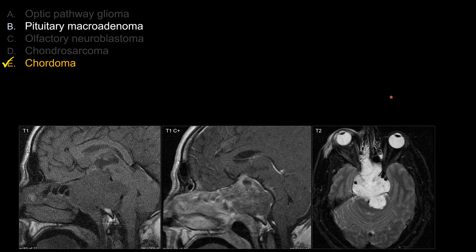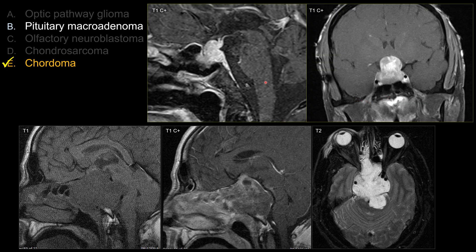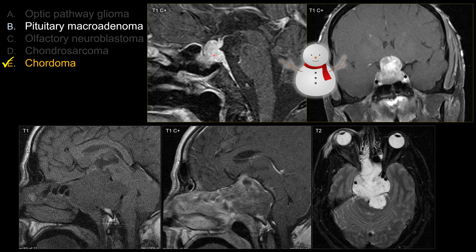What about pituitary macroadenoma? Even though a more aggressive one can extend into or erode the clivus, the natural tendency of pituitary macroadenoma is expansion of the sella with suprasellar extension and the classic snowman configuration. The key is that you should not be able to distinguish the normal pituitary gland from the macroadenoma. Whereas with chondrosarcoma or chordoma, unless the lesion is large and causing complete compression, you can typically see the pituitary gland separated from the chordoma.